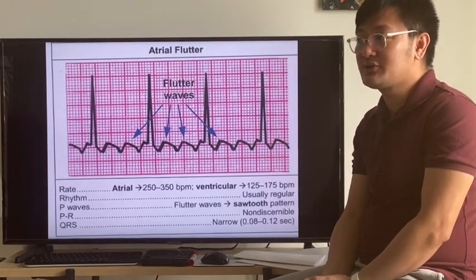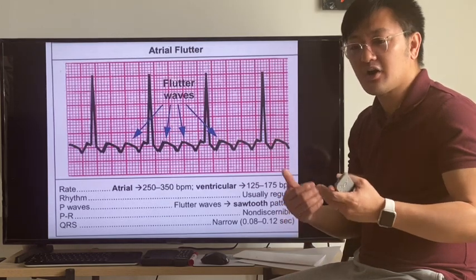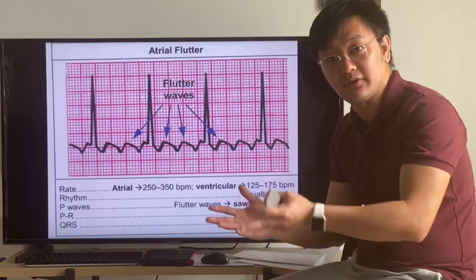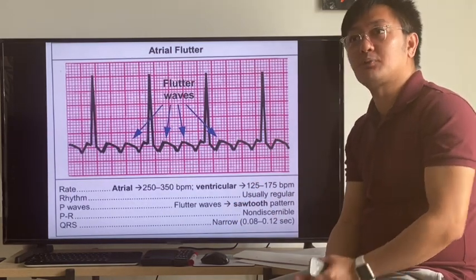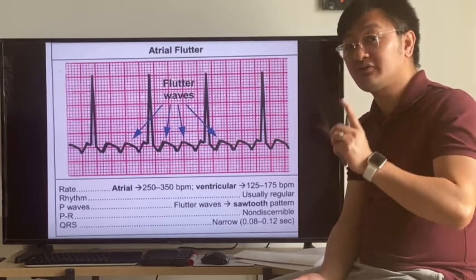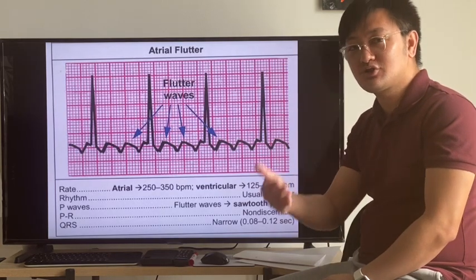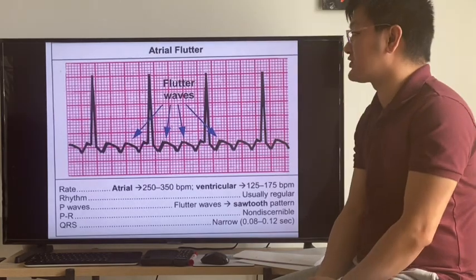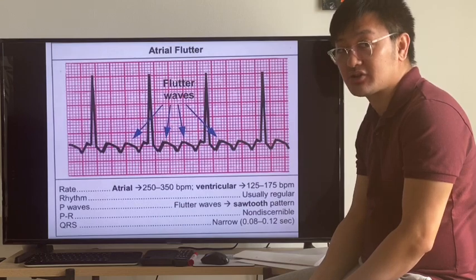What's good with cardioversion is that we start with the smallest energy delivery, or smallest joule. Usually, we start at 50 joules, then progress from 50 to 100, then 150, then 200 joules. So 50 joules, 100 joules, 150 joules, then we give 200 joules as max. That's your cardioversion. So this is what we call your atrial flutter.